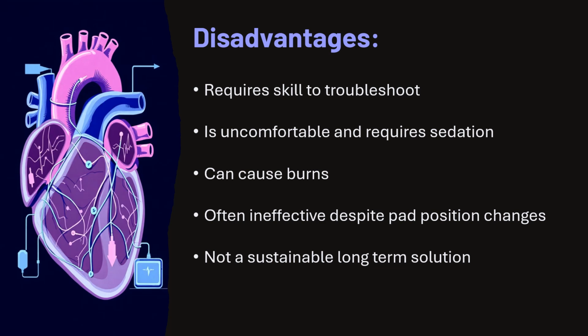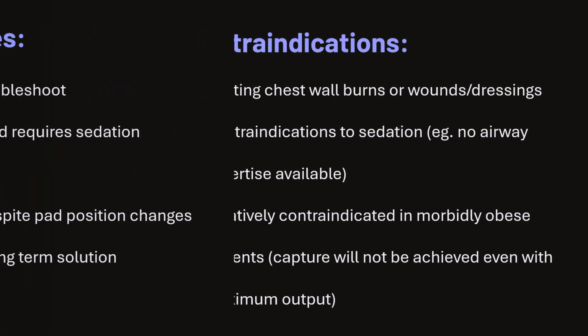Uncomfortable, requires sedation, sometimes pain for the patient, especially if conscious, can cause burns if we use high amperes, especially in obese patients. Sometimes ineffective despite pad position changes because the patient may sweat, or with changing the patient's position the pads get loose and not well fixed. Not a sustainable long-term solution. It needs to be changed to transvenous, for example.